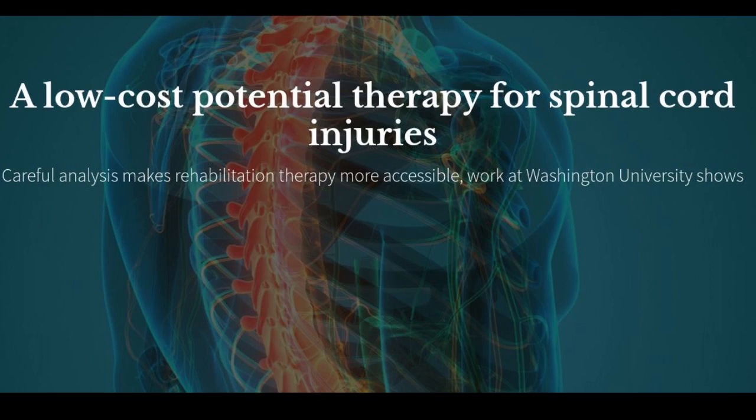For instance, a single electrode configuration gives a patient a very general stimulation that activates essentially all motor neurons below the spot on the spinal cord being stimulated. So, instead of specifically flexing the hip, for example, a patient might just jerk the whole leg. With a focused study, Sianes hypothesized that they could create a set of guidelines that can be used by medical professionals. Sianes' team recruited 16 participants without spinal cord injury to test their TSCS setup.